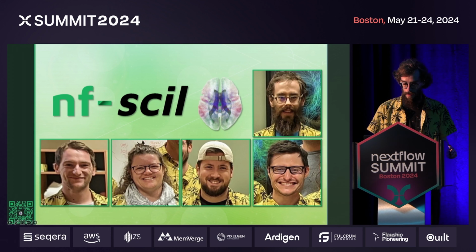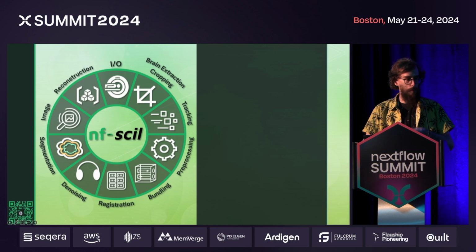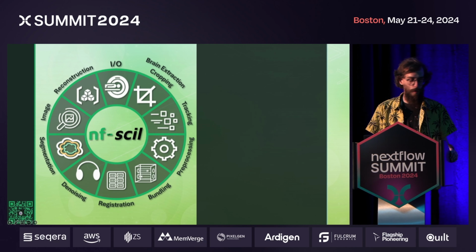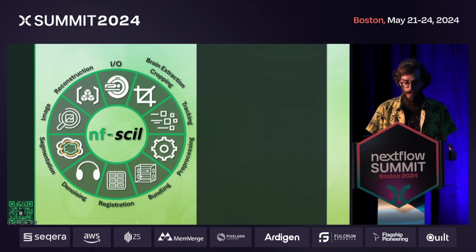The initial goal that we had was to take all the common parts of our pipeline and put it inside of the nf-core framework. And so for that, we created a big compendium of modules. It was quite easy, given that nf-core has a really good documentation and a really good tutorial that you can follow. We also created a whole collection of sub-workflows using those modules.